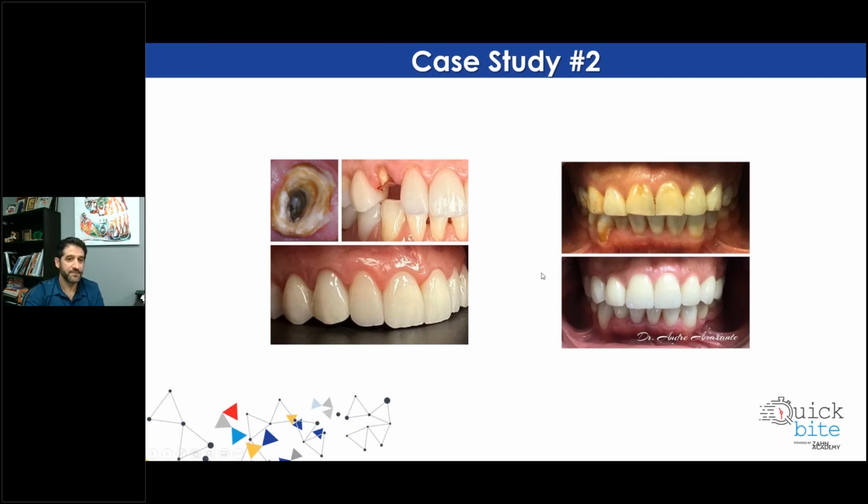On this case over here, you see how dark the patient's natural teeth are. After they're prepped, they're like A3.5, maybe A4. So again, we wanted to create something that had a very strong bite. We did a full mouth, upper and lower. And the doctor wanted something that will not break and will mask everything under it. And obviously they wanted aesthetics. The patient did it for aesthetic reasons. So again, we went with the Zirlux transition for this case, which basically we do for everything.